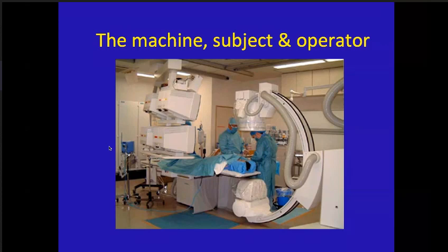There are three major components to give you a diagnosis. Of course, the machine is very important. The subject: you have to do a procedure safely and get him out of it. And the third most important thing is you, the most important person, who does the interpretation. The first two factors will not give you the interpretation. You have to interpret it with the use of this piece of equipment.